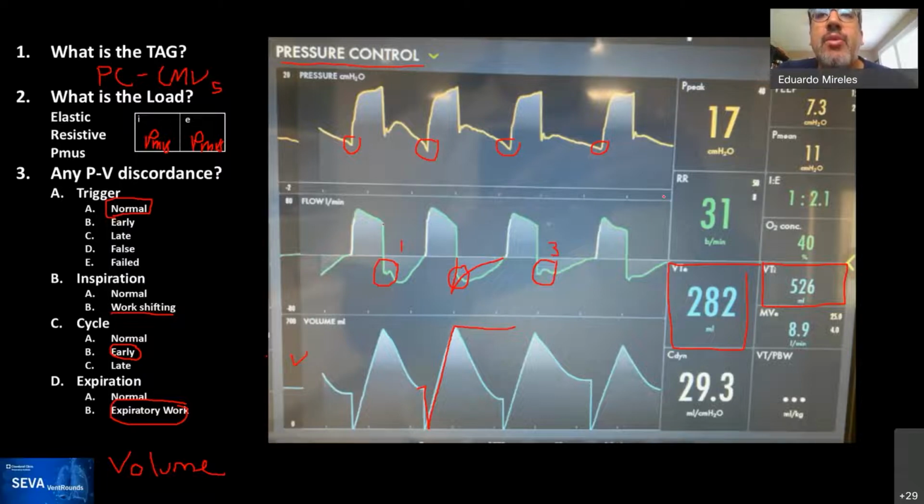One of them, and we have seen this in patients that have issues with tracheostomies, or even with the ET tubes, have been intubated for a fair amount of time, have tracheomalacia, or they have very low compliance and require high pressures to ventilate them. You can't reach the amount of pressure to maintain a safe tracheal pressure, inflation of the balloon, when you're ventilating some of these patients. So there may be leaks during inspiration.